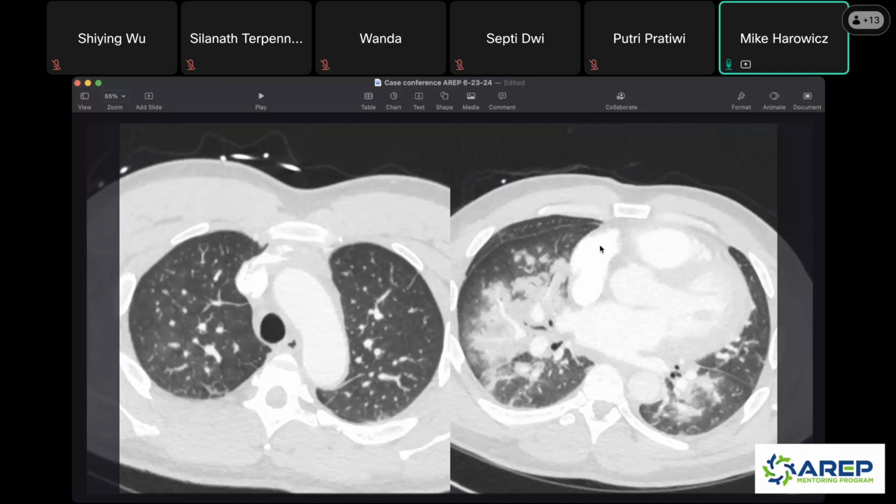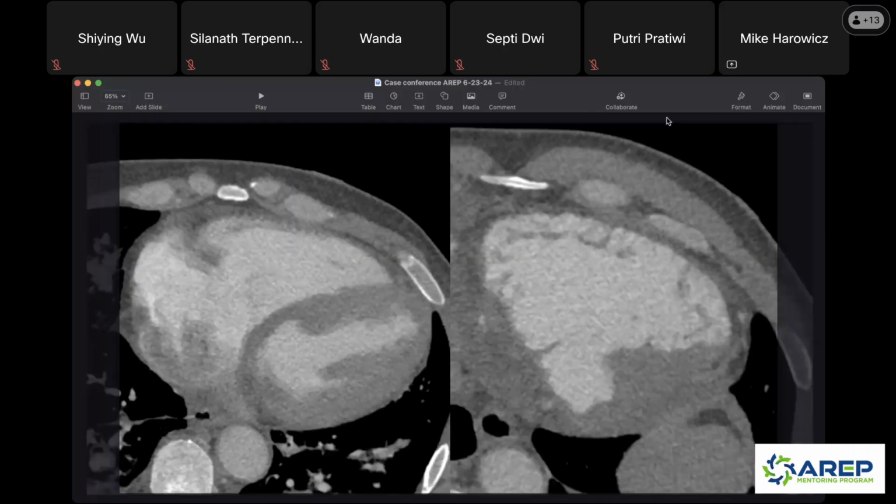Now you'll notice there's contrast in the heart and in the vessels, so you should always look at them if things are contrasted. And I'm zoomed up here. So these are two axial images. I'm just magged up on the heart. It's a little motiony. You could tell if you look over at the right atrium and the right ventricle here, there's some motion, but you could still see things pretty crisply, right? So everybody take a look, and to point out right atrium, right ventricle, left ventricle.